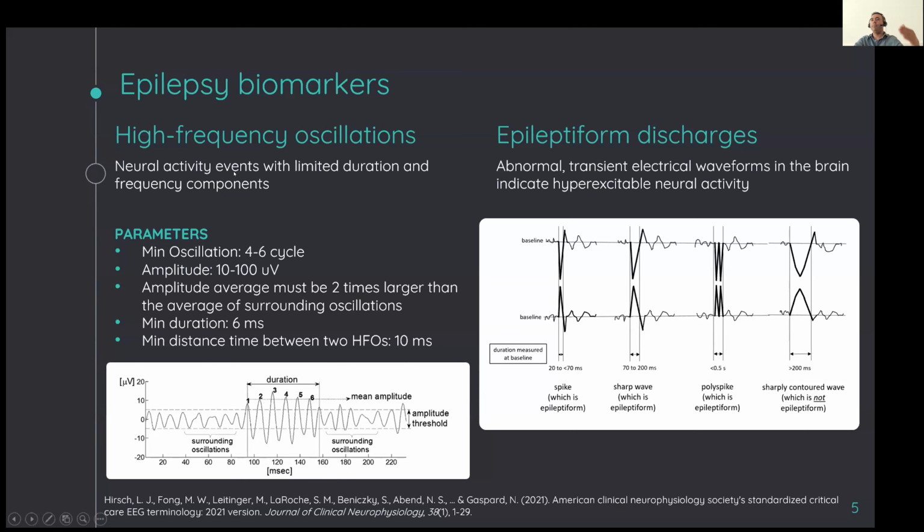So the HFO itself is divided into two parts. We call it pathological HFO when it is any unprovoked HFO carried by a spike activity. In the left image, you will see a spike, on top of that, in a different frequency range.